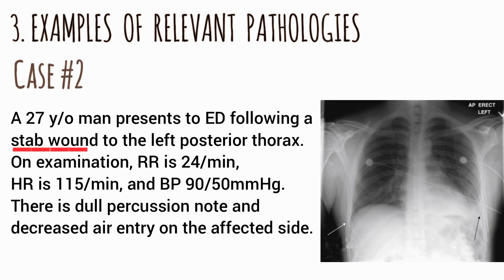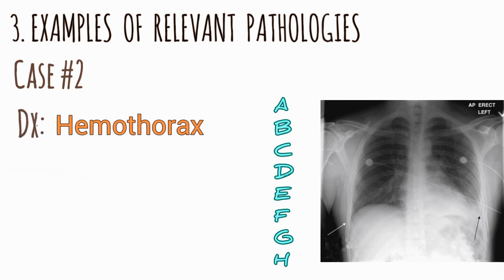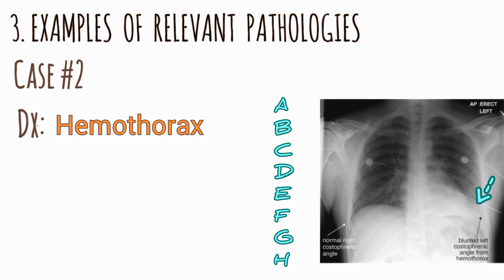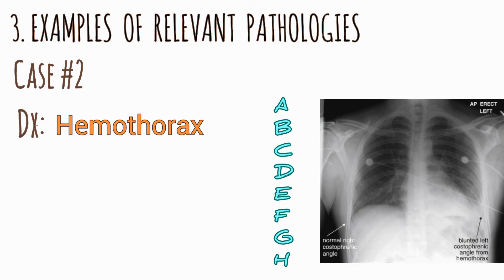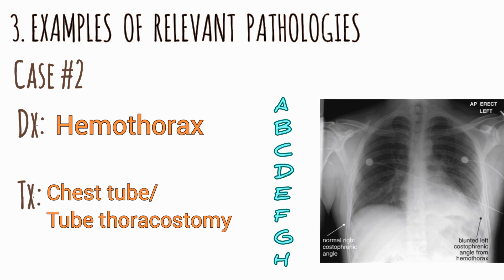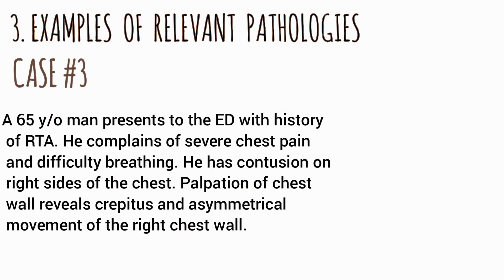The second case involves a patient with a stab wound and a dull percussion note, suggesting blood in the chest cavity — hemothorax. On the chest x-ray, the left diaphragm and heart's border cannot be clearly identified, there is blunting of the left costophrenic angle, the area appears whiter, and a meniscus sign is visible. These three signs indicate the presence of fluid — hemothorax in this context. Management is by chest tube insertion, which can also be diagnostic without x-ray.